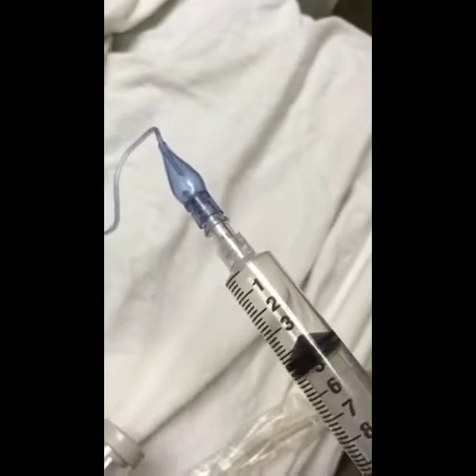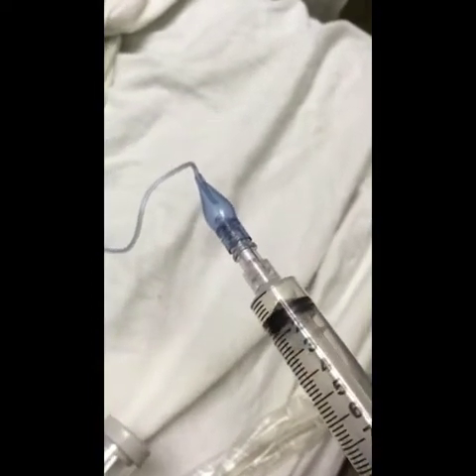If the pilot balloon doesn't hold any air, then you've got a problem. Our hope is always that it's just a leak in the pilot balloon line and not in the cuff itself. You can place the Pressure Easy device in line with the patient's circuit. It will take lost air from the circuit and place it back in the pilot balloon line to maintain patency. However, if this does not work, your pilot balloon continues to go flat despite putting air in, and you continue to have a leak, you may need to contact a physician. It's possible you have a blown cuff.